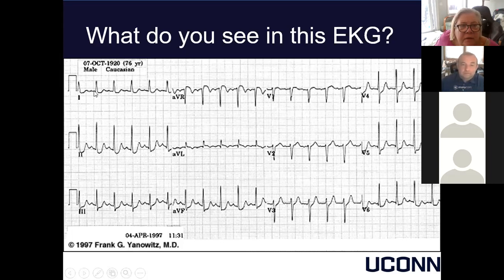Well, looks like some ST depression in 1, ST depression in 2, 3, ST elevation in R, a little bit in L. Depression in F and V1, some depression in V3, 4, 5, and 6.